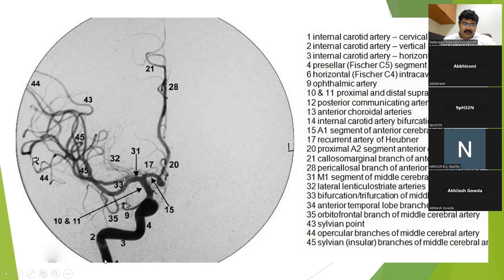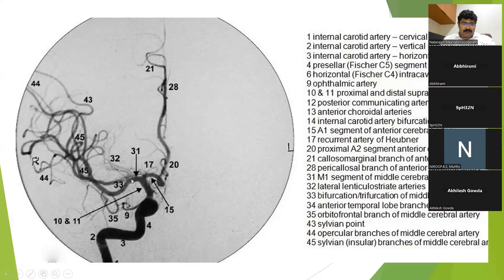This is the vertical cervical part, then the vertical Petrous and the horizontal Petrous, and then the Cavernous segment. Then this is the Ophthalmic Artery. This is the A1-ACA, and this is the M1-MCA.